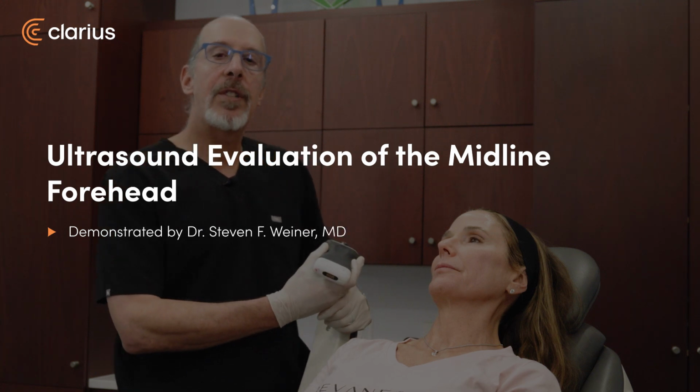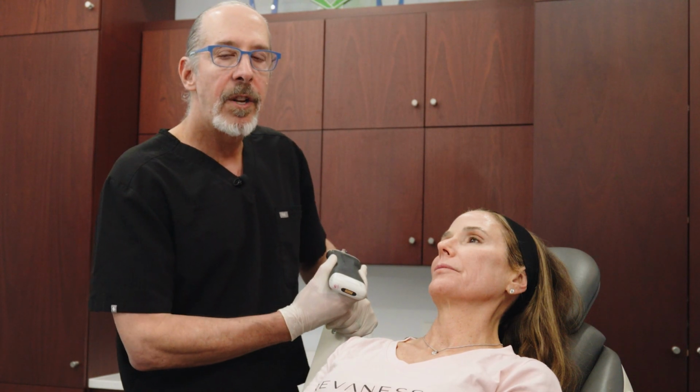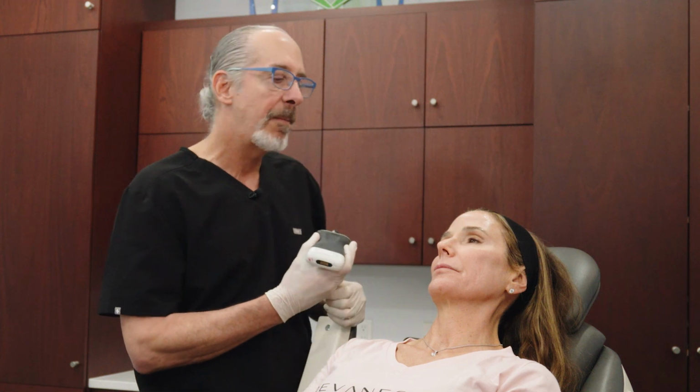So there are two vessels in the forehead that you need to be aware of, the supratrochlear and supraorbital. The supratrochlear artery is going to be approximately 1.4 centimeters from the midline, and then the supraorbital artery is going to be another centimeter lateral. So there's 2.4 from the midline.